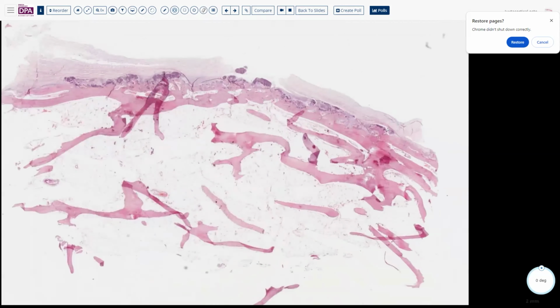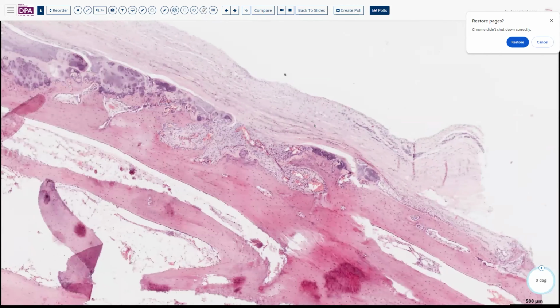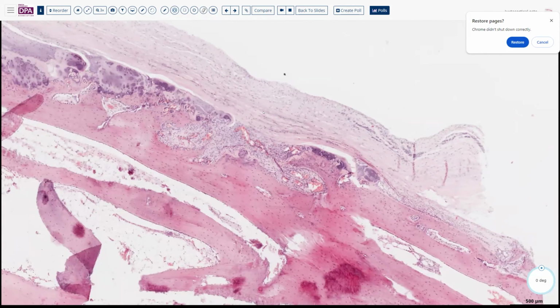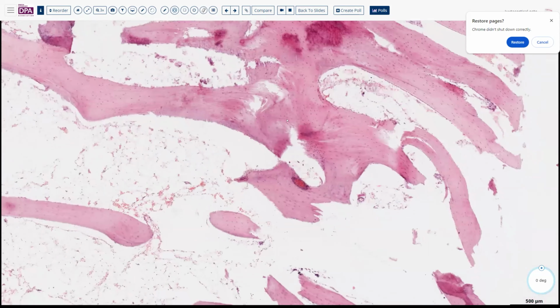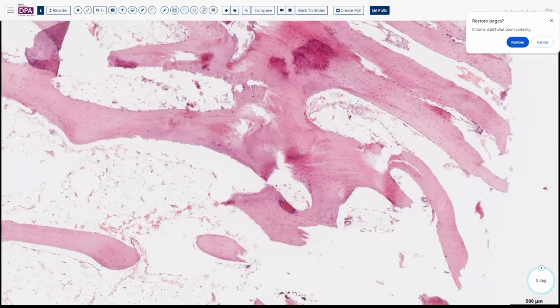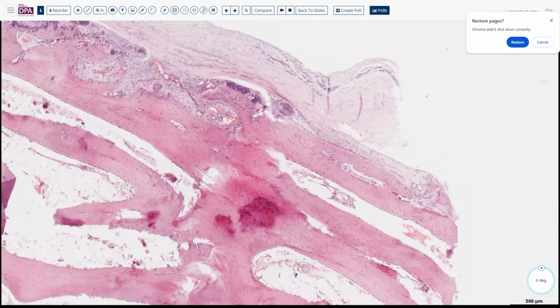So here is what we see. We have this periosteal tissue out here. And this is, mind you, from the diaphysis of this bone, not the epiphysis or another part of the bone. We can see that the patient's still fairly young based on the degree of reorganization of their Haversian systems here. Actually, he may be younger than 23 based on this appearance. You can see here, we're still looking at primary lamellar bone, so he may actually be in his early teens. I may be misremembering the age.